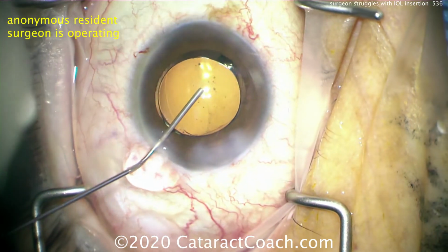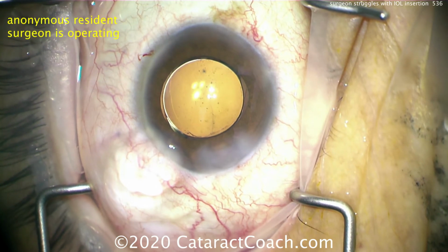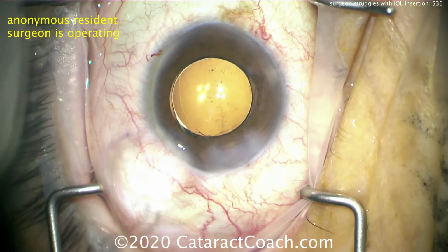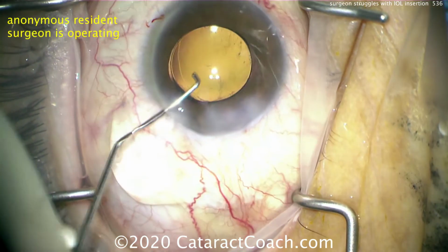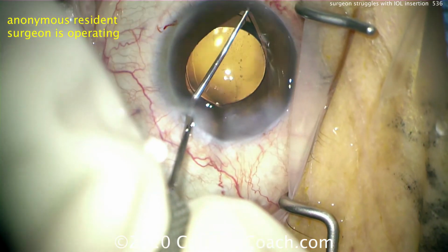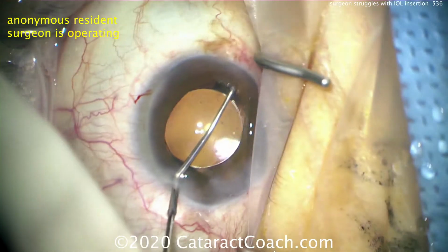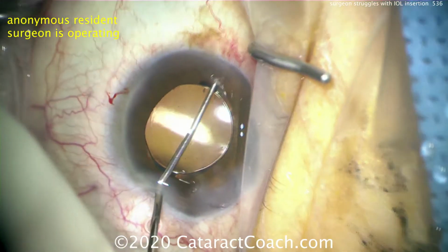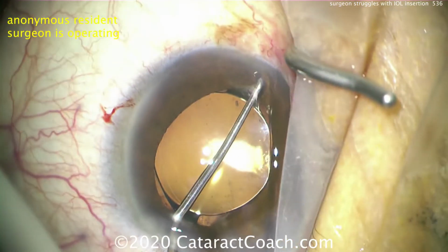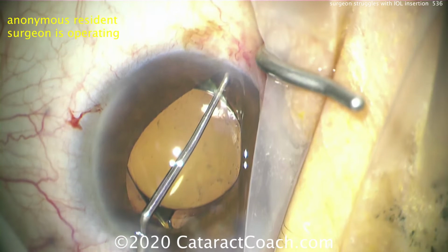Well, let's look. This is more viscoelastic going in the eye. There it is. Refilled the capsular bag, refilled the AC with cohesive viscoelastic. Now let's go and look with the chopper. Let's tent this up and zoom in. Oh, what do you think is going on here? It wasn't just the trailing haptic that was causing the issue. The leading haptic is in the sulcus, above the capsular rim.